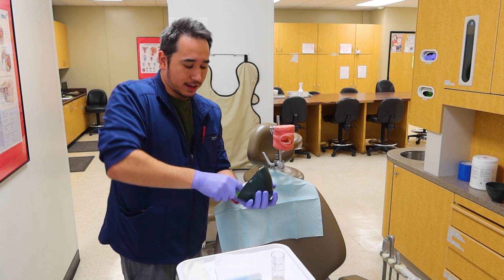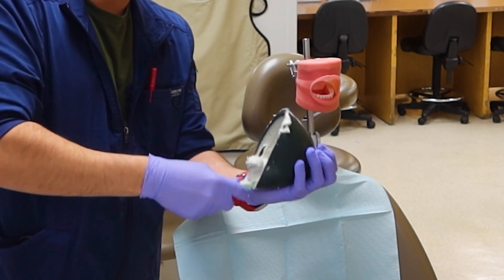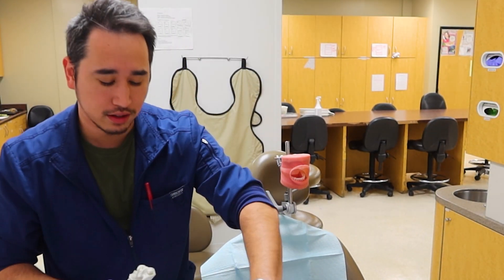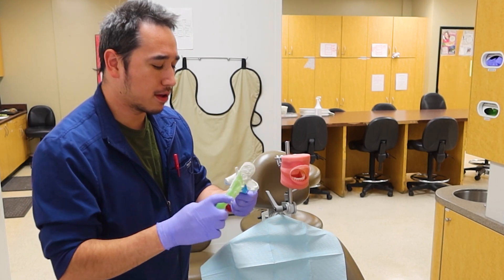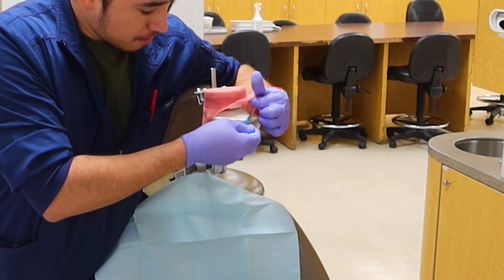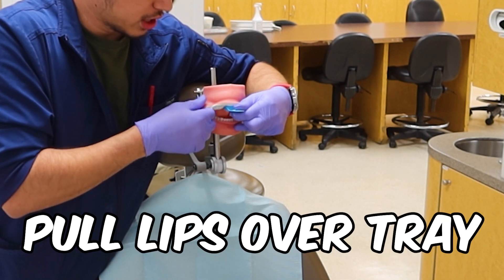Get your mix going — smash and slather. Some do nice butterfly techniques; some move the whole bowl around in their hand. The main point is to get it nice and creamy. Now that it's mixed, gather everything up in one go, put that down, grab your maxillary tray, load it from the front, and make sure all the areas are nicely filled up. Now that the alginate impression is ready, get your patient — come up from behind them, pull their lip off to the side, sweep in from the other side, center yourself so the anterior teeth match up with the anterior portion of the tray, seat in the posterior, seat in the anterior, and pull those lips over the impression.